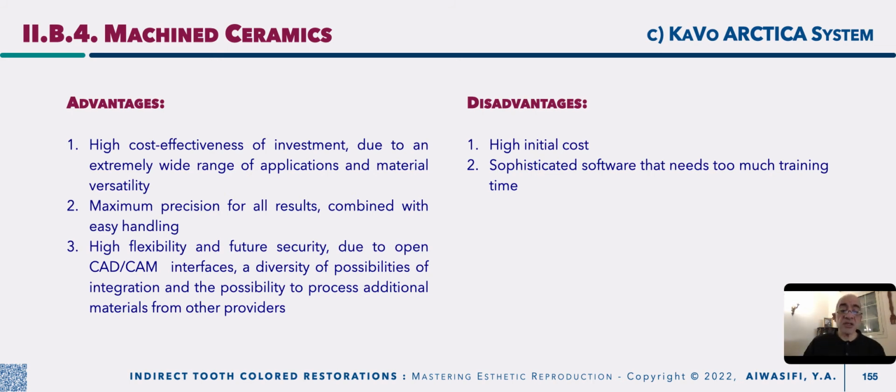Its disadvantage is the high initial cost, but the most important one is the sophisticated software that needs too much training time and too many updates of the system, and every time you need to be trained in using this.